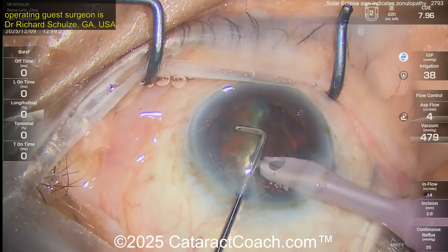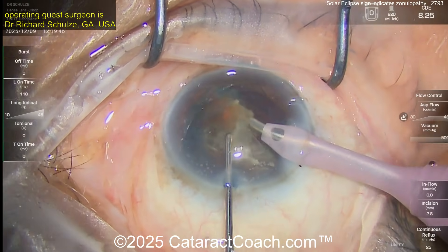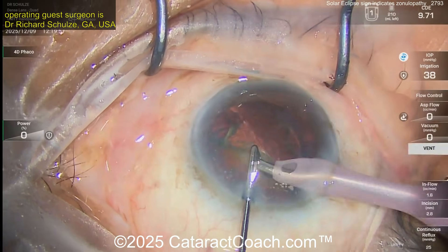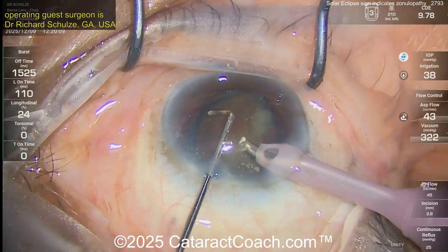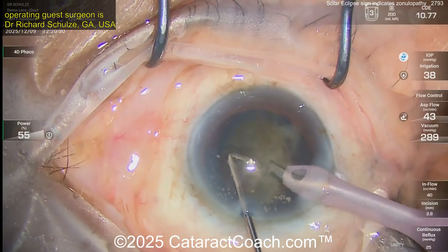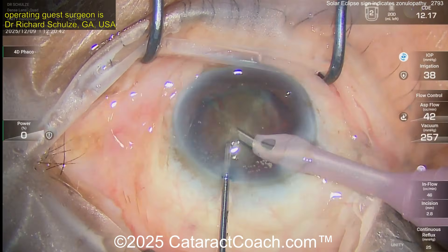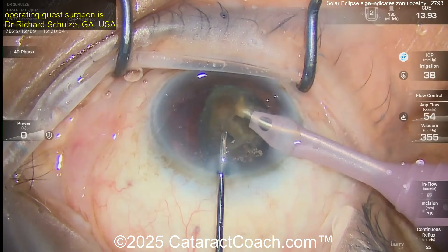Buzzing again with the phaco probe — a nice horizontal chop, cleanly done. There's a good amount of lens density there, but pieces are coming up pretty easily. The CDE energy is pretty low. I've tried this new phaco machine — I have no affiliation with this company — but I found I'm using about half the CDE compared to what I was expecting. Very interesting advances in technology are coming our way. Buzzing into the nucleus with the phaco probe to get that last piece out.